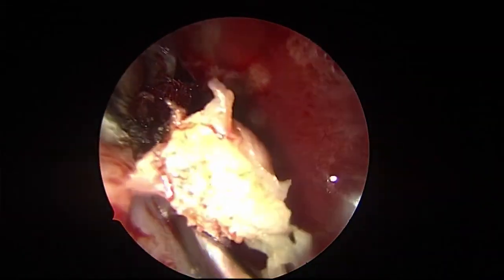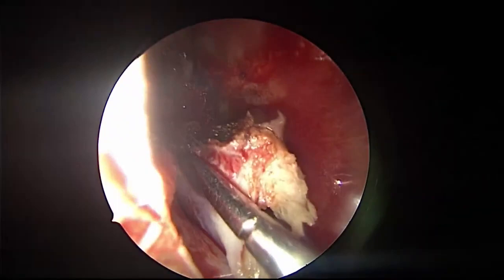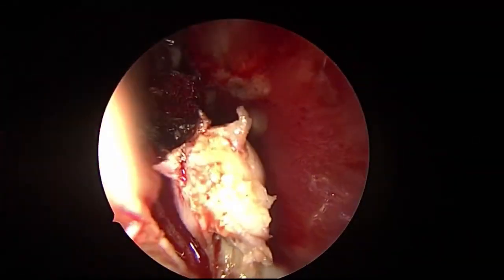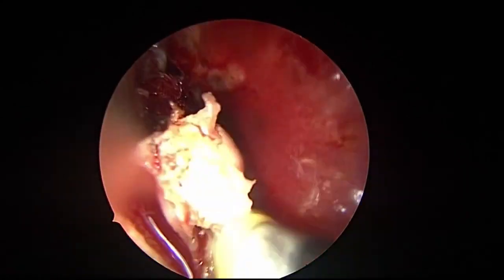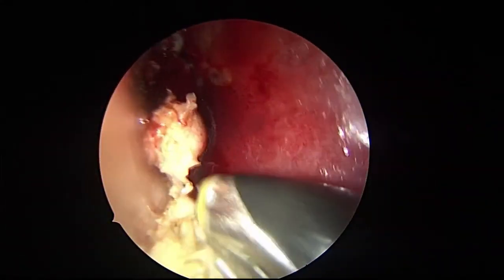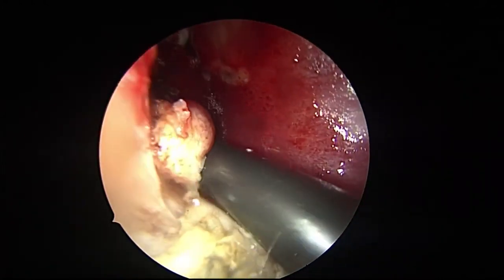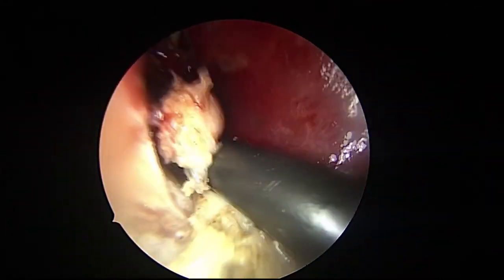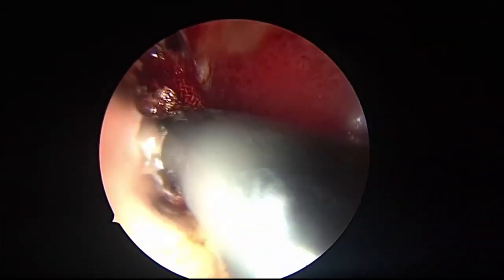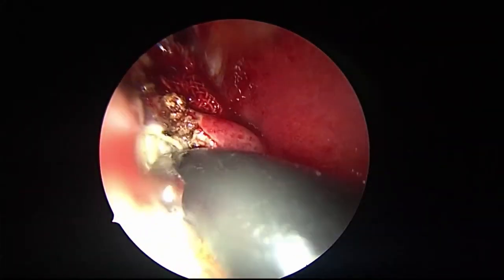Now see, this is the inferior turbinate. Can you see this? This is a separate bone. That's not a part of the maxilla. And see my level, below the level of the floor of the nose. This is the inferior turbinate being elevated.